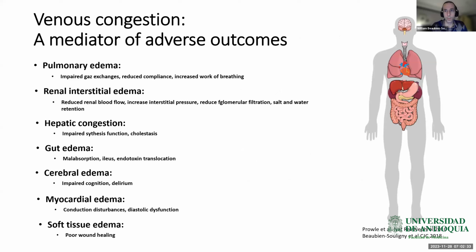So here is a very interesting study by a Japanese group done in 2016. In this cohort study, Ueda and colleagues studied more than 200 patients, about three quarters of whom were hospitalized patients, but also outpatients. And they assessed the pattern of intrarenal venous flow in these patients who were known for congestive heart failure.